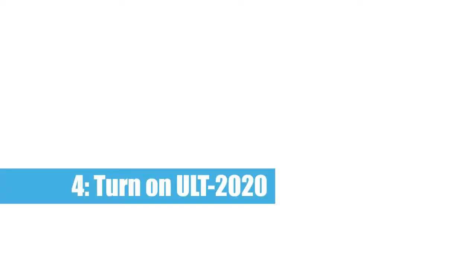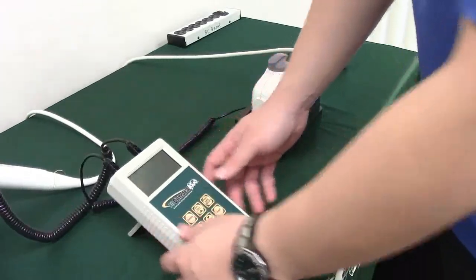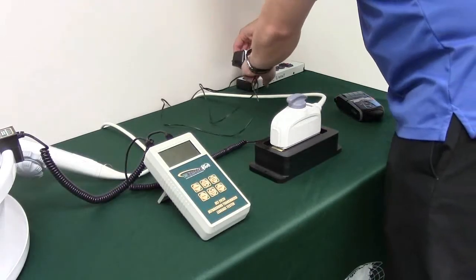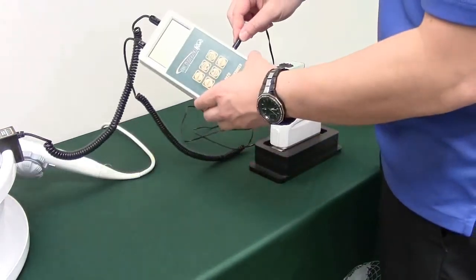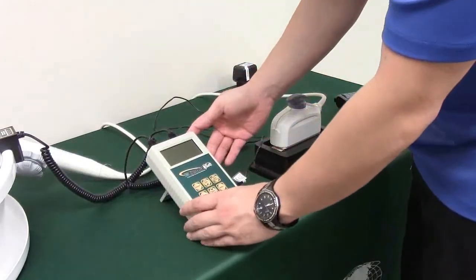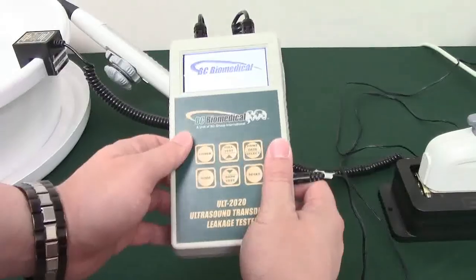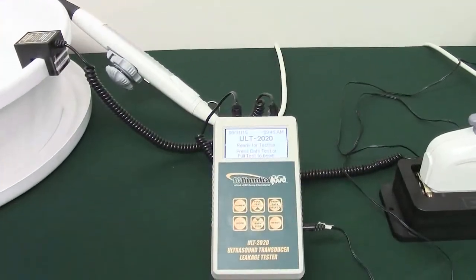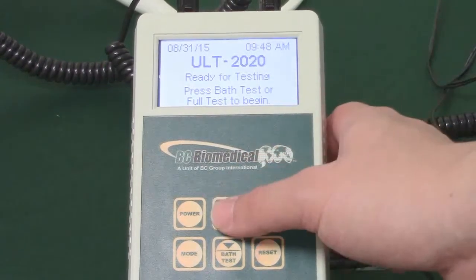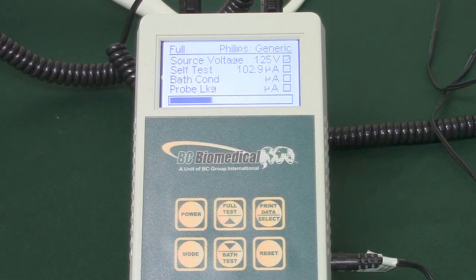Step 4: Turn on the ULT 2020. Press the button marked power on the ULT 2020. The screen should light up. If not, check to ensure the tester either has batteries or is powered by an AC adapter. Once on, simply press FULL TEST to begin the test. The machine will do all the work. You just need to wait for the results.